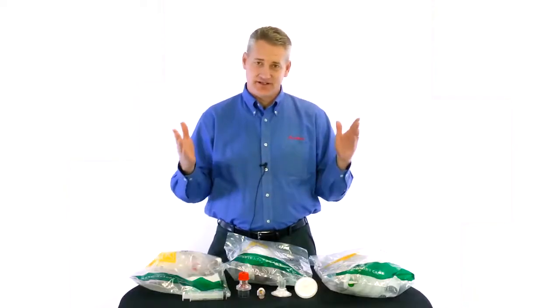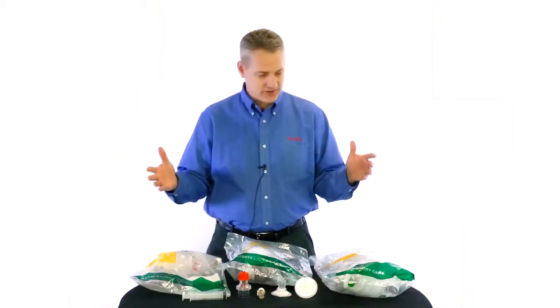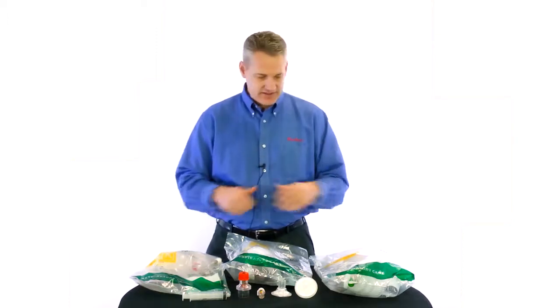Hello, everyone. This is Neil Harbstreit here at Ambu, and today I'm going to give you a brief in-service on our pediatric resuscitators. We have a number of different configurations, but they all work off of these three basic configurations.